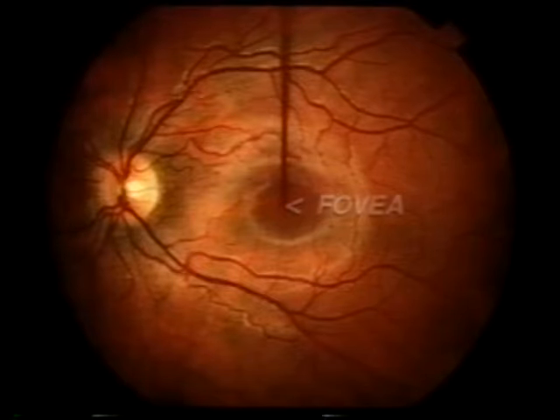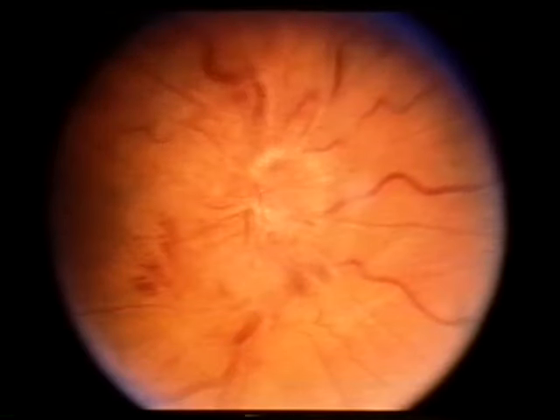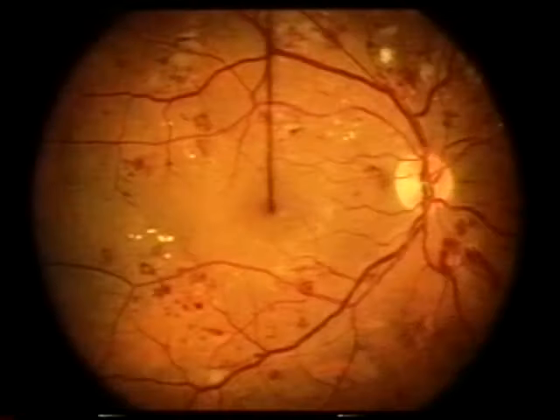Here's an example of a patient with a swollen optic nerve due to a brain tumor. In this picture, you cannot see the optic disc margin, the optic cup, or the blood vessels as they emerge from the nerve. Here's an example of retinal disease caused by diabetes.